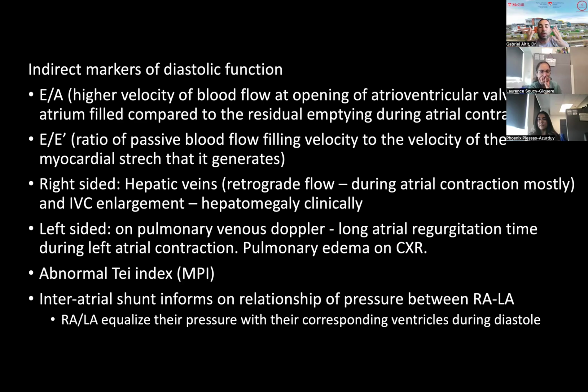It's going to be an overall picture of the patient. So we're going to look, for example, in a patient with infant of diabetic mother that has a lot of LV hypertrophy, we're going to look at how is the LV able to fill during diastole. Is there systolic anterior motion of the mitral valve? Are we getting a lot of aliasing or LVOT signs of obstruction? Is the output in the LVOT diminished?